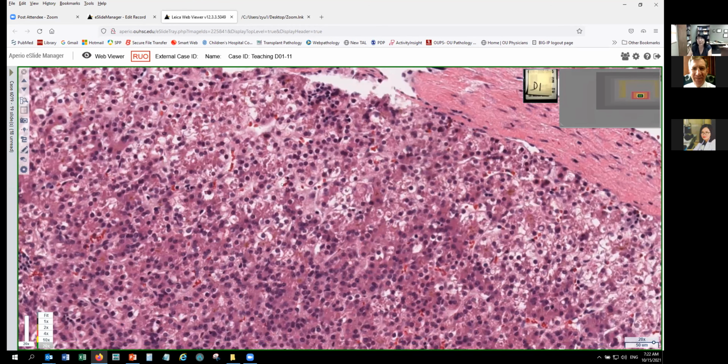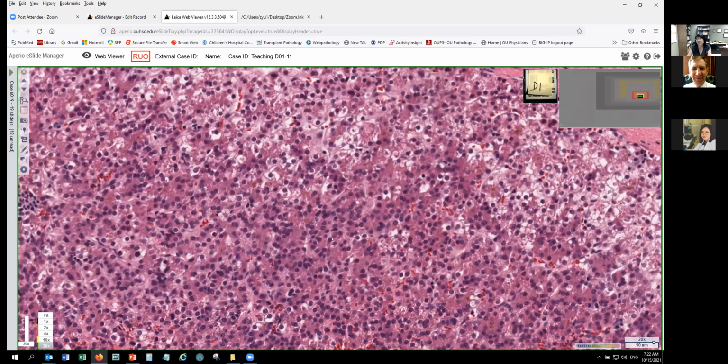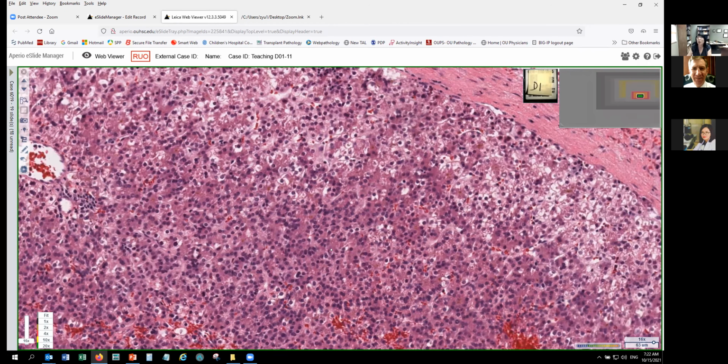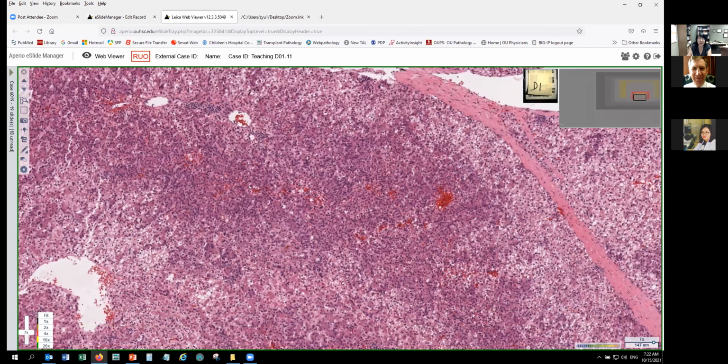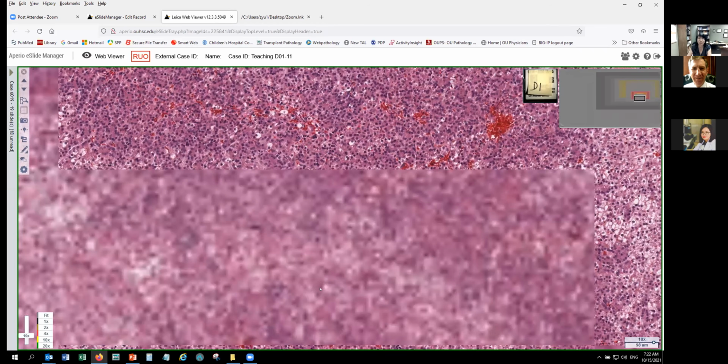When you decide it's a fetal type, you want to decide how much mitosis. If there are more than 2 mitoses per 10 high power fields, that's called the mitotically active type. If fewer than 2 mitoses per 10 high power fields, we call it mitotically inactive, the well-differentiated type, which usually has a very good prognosis. So that's what the tumor looks like: dark area, light area, and extramedullary hematopoiesis. And this one has some mitoses, more than 2.